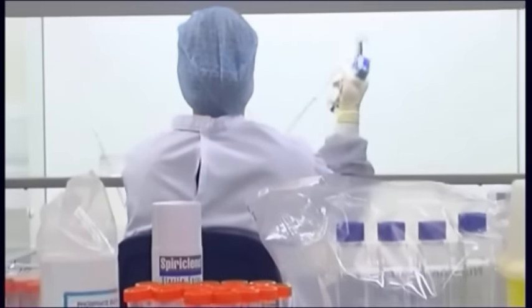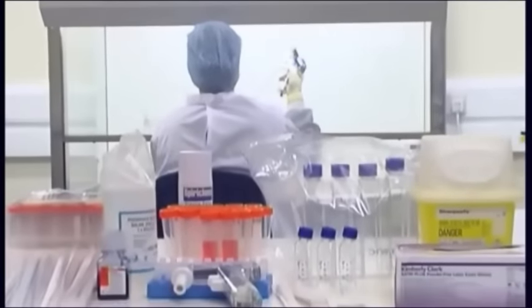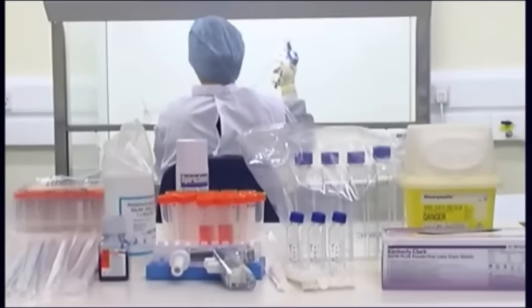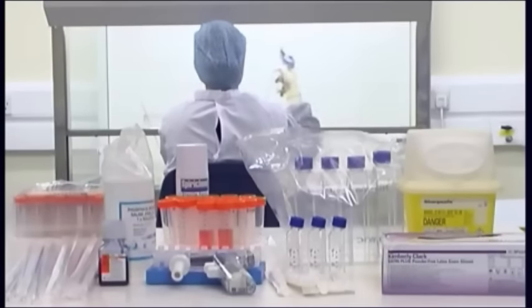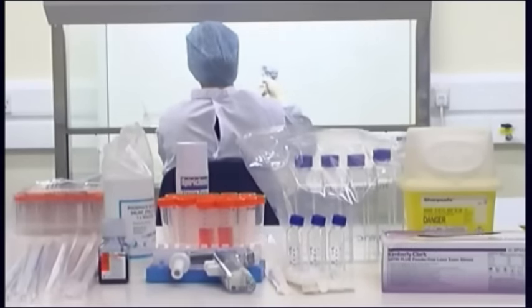Consumables: An effective laboratory will have a wide range of consumables available. The majority of cell culture flasks, centrifuge tubes, and pipettes are available in single-use sterile packs. These ensure a high level of quality assurance and eliminate the need for validation of cleaning and sterilization procedures.